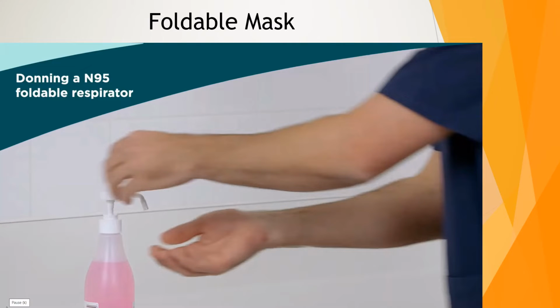I'm going to show you some different videos now on how to fit the different shaped N95 masks.